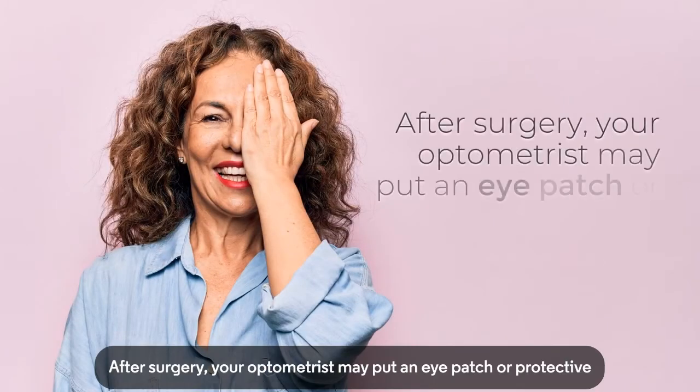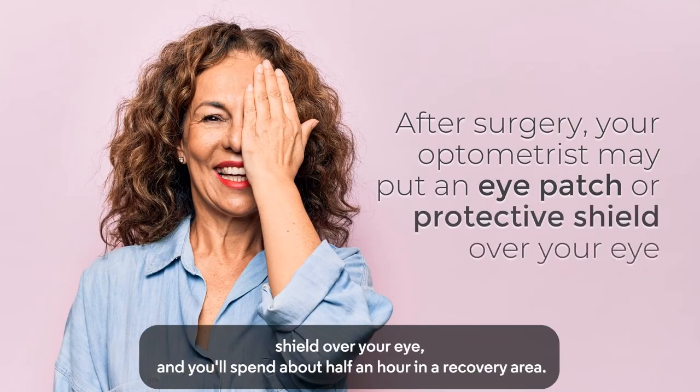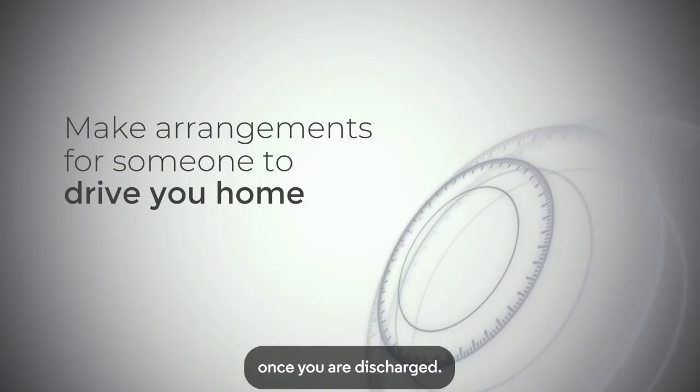After surgery, your optometrist may put an eye patch or protective shield over your eye, and you'll spend about half an hour in a recovery area. You cannot drive immediately following the surgery, so be sure to make arrangements beforehand for someone to drive you home once you are discharged.